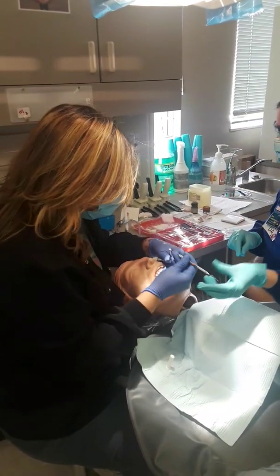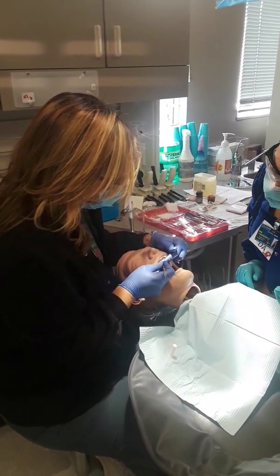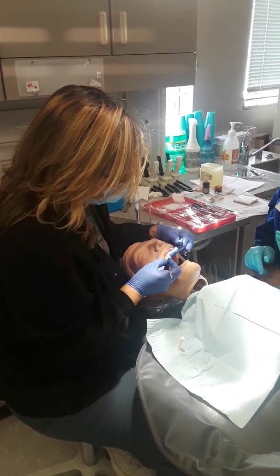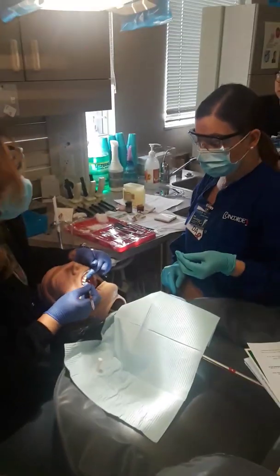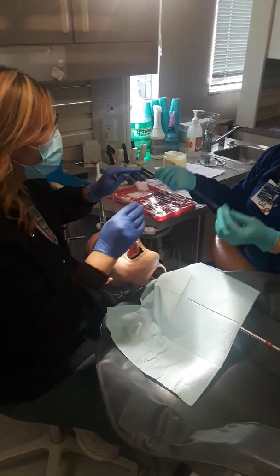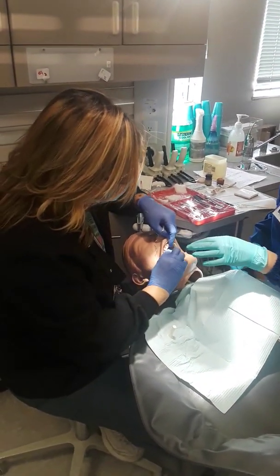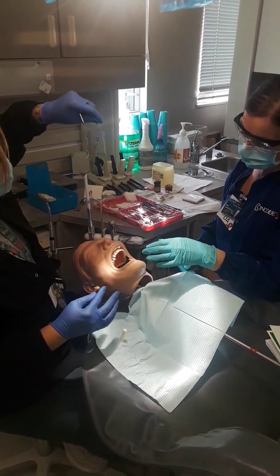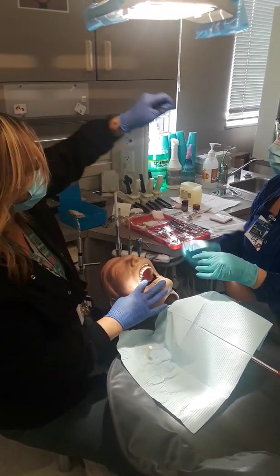Now we're going to clean the cement with an Explorer while checking the margins. The doctor's not going to get this instrument without checking what he needs to check as well. We have to check the margins again because this time we added cement on the inside of the crown, which changes everything. So remove cement. Now she's going to plastic floss. This time we're not checking the contacts. We're actually going to slide a knot through the gingiva to loosen any interproximal cement. I'm not going to pop it down. I'm just going to pull it through.